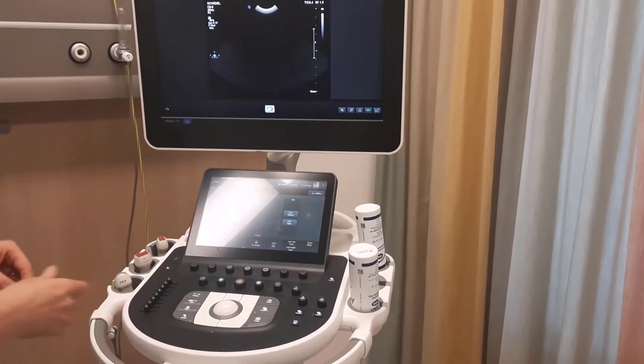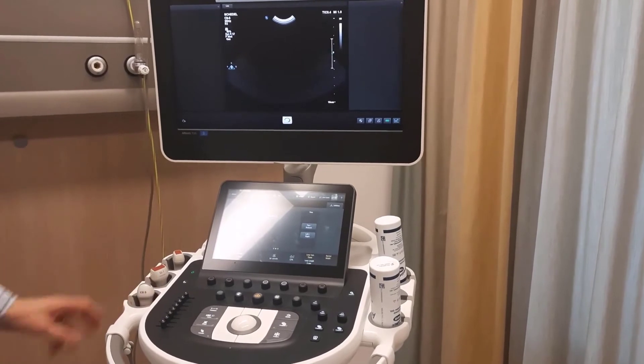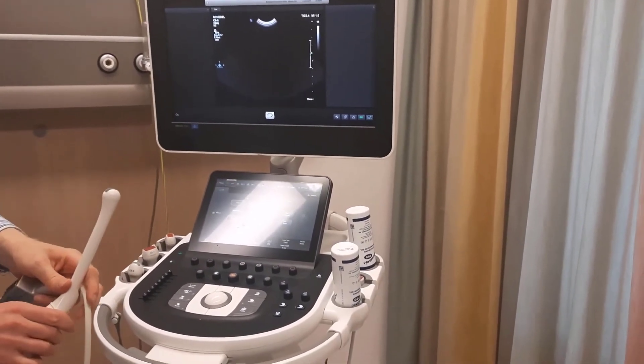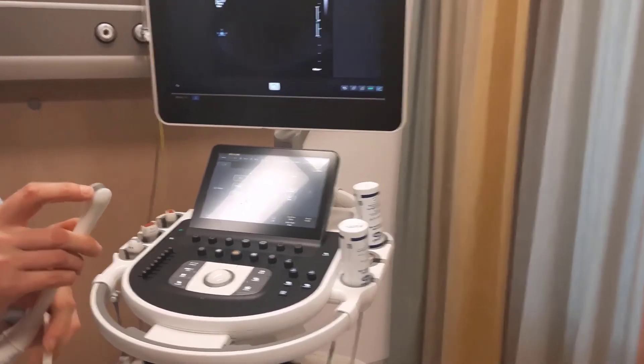This transducer is 100% good, so you don't have any problems with this one. We also have a transducer which is damaged. It is very hard to see, but it can be a big problem.